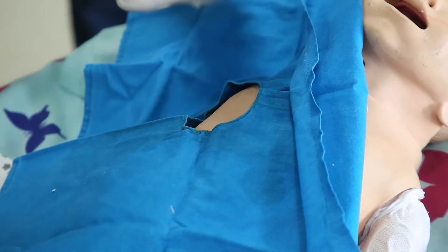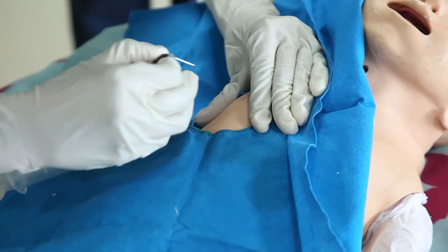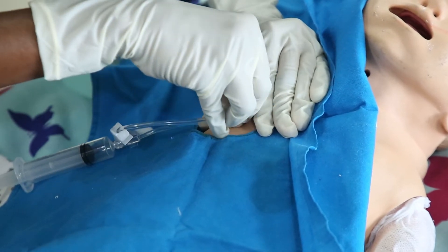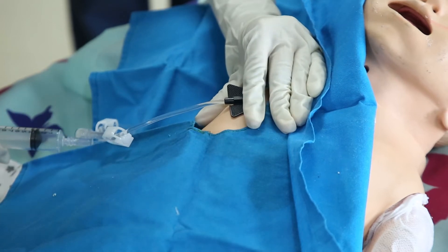She will then palpate the port and insert the chemo port needle, holding the wings perpendicularly into the center of the port's septum. Change the site with each access. Do not use the same hole for each access as it would lead to skin breakdown and infections.